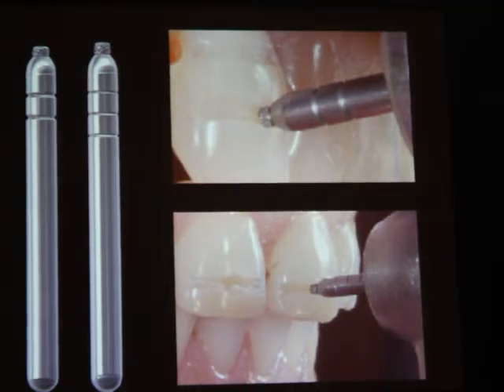Ngoài ra thì chúng ta có hệ thống đánh dấu chiều sâu bằng hệ thống mũi khoan này, thì nó có những mũi khoan 0,1, 0,2, 0,3 thậm chí cho đến 1 đến 2 mm để đánh dấu chiều sâu. Thì chúng ta cũng sẽ tạo một rãnh lên bề mặt ngoài của răng, sau đó dùng một bút chì để đánh dấu đáy rãnh rồi tiến hành mài.